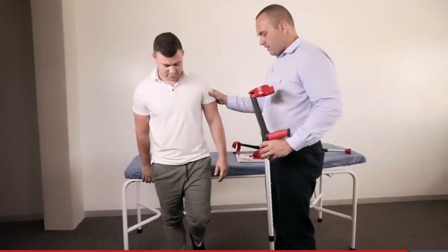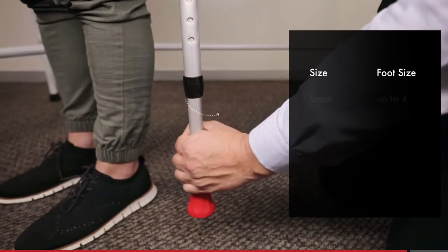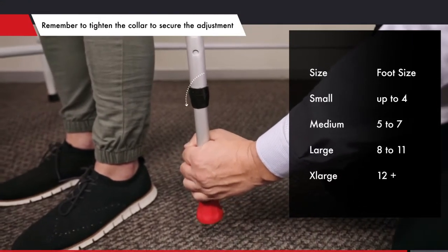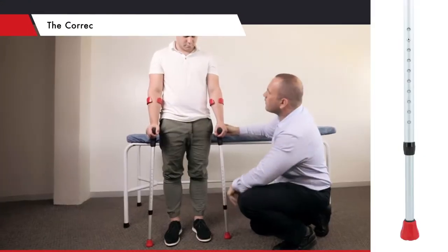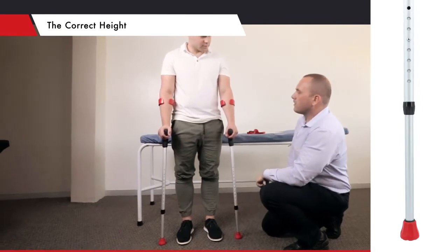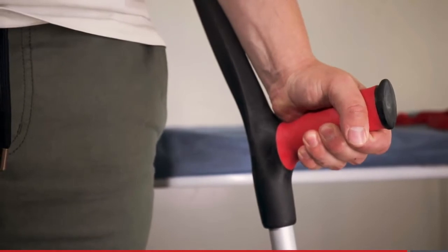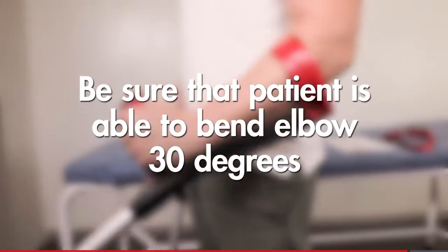First, you need to adjust the crutches to the correct height for the patient. Ask them to stand with their arms relaxed by their side, wearing their usual shoes. The hand grip should align with the patient's wrist. The patient should be able to bend their elbow 30 degrees when holding the hand grip.